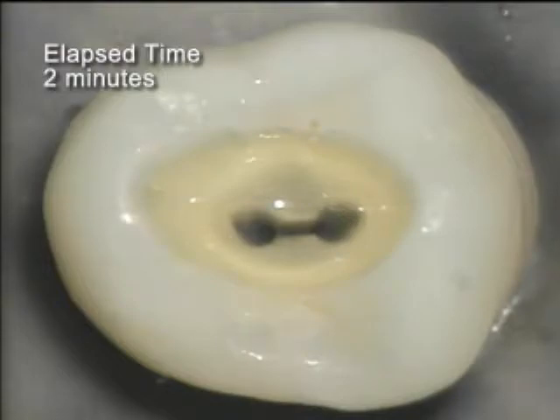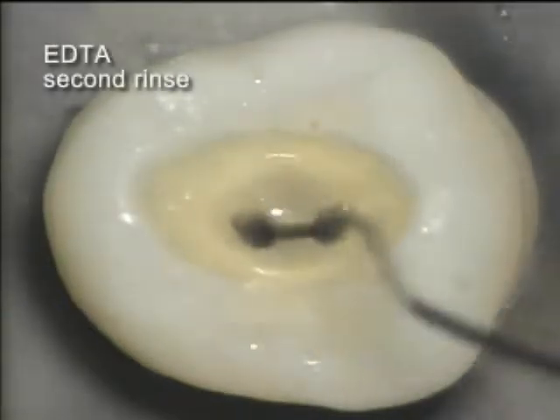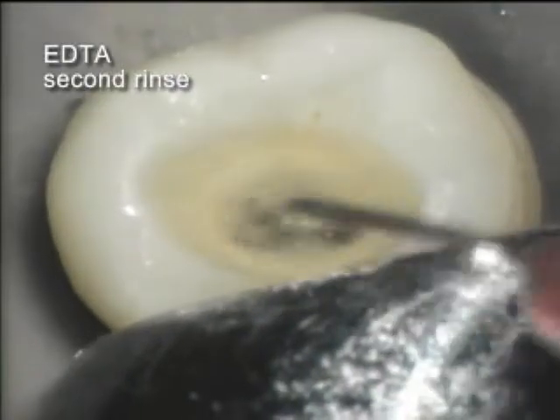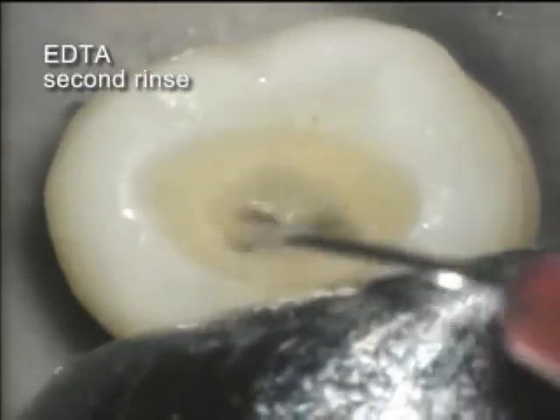In this instance, two minutes pass and a second rinse with EDTA is performed. No debris can be visually detected during the rinse.